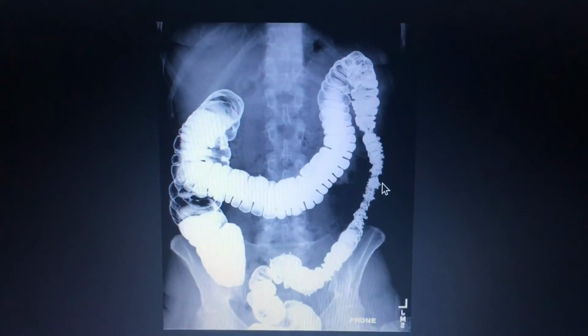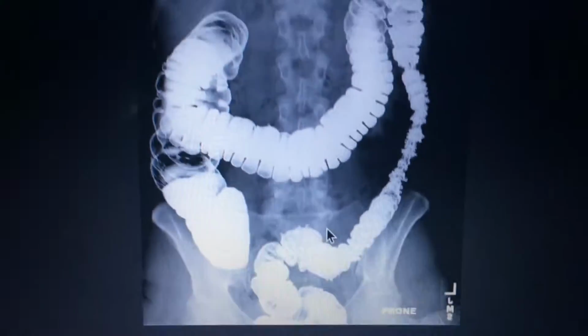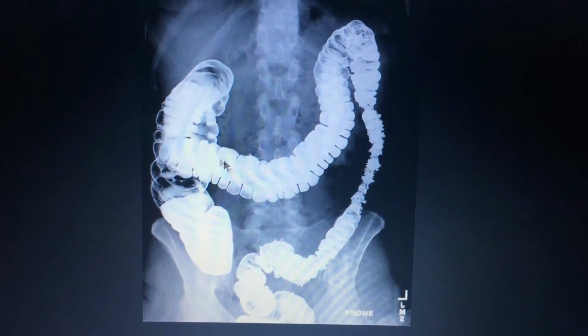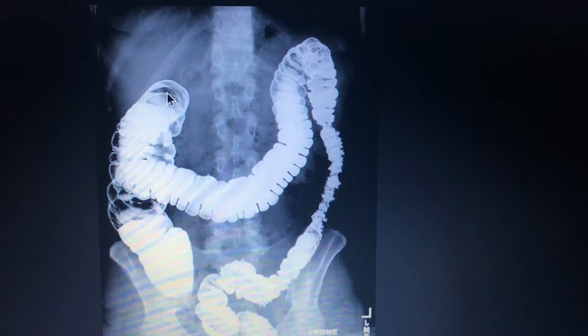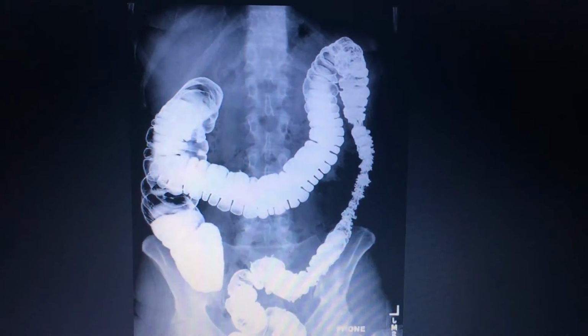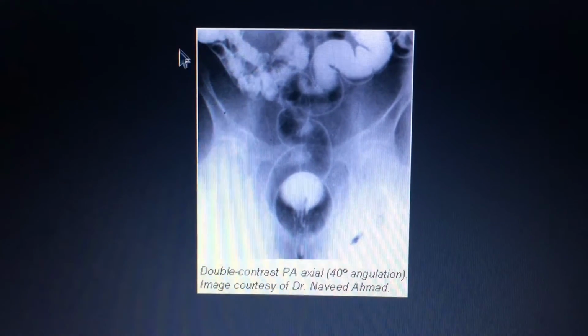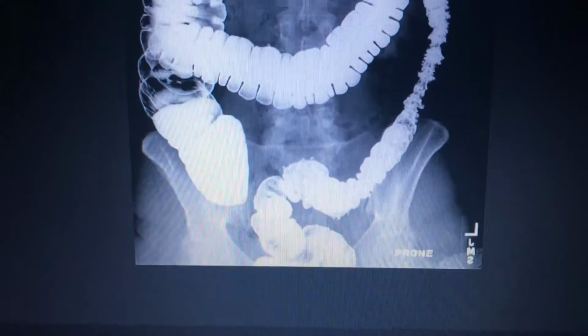You can see some pathology here. Looks like some Crohn's going on and some diverticulum. And we have the left and right colic flexure. You'll be able to see those more opened up in the obliques. This would be the PA axial of the sigmoid. I actually said it was the rectum in my video, so that's another correction. They do an axial so that you can see the sigmoid more. Since it's in an S shape, it superimposes itself when it's not angled, as you can see there.